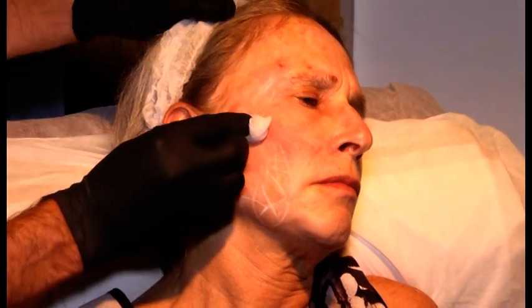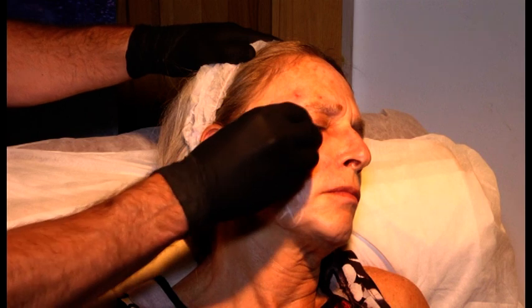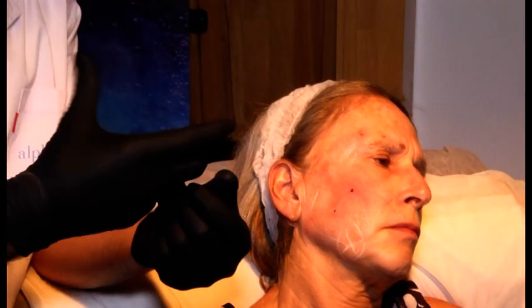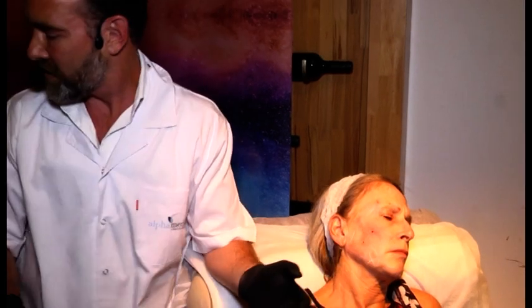And I will show you how to mix, because as you could see, this was a little bit compressible. And you know, these girls don't have so much experience with mixing diluted Radiesse, and there's always these little air bubbles that get trapped inside. This is a little tip that I want to give you guys, because it's a little bit annoying if the gel contains a lot of little air bubbles, and you start pushing, and first you compress the gel, and then it starts flowing. So, I will show you how to mix it.